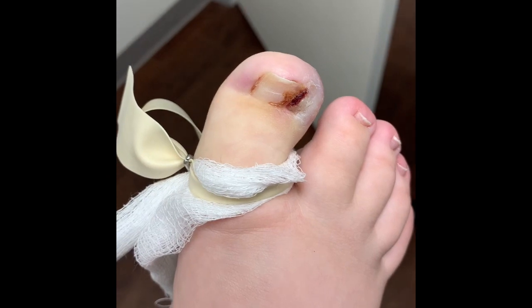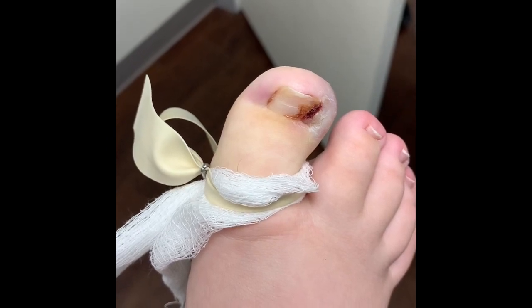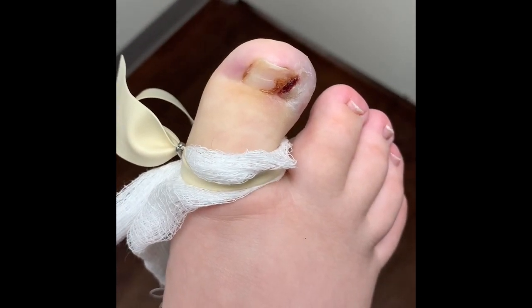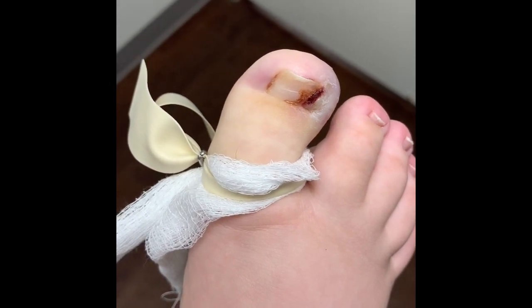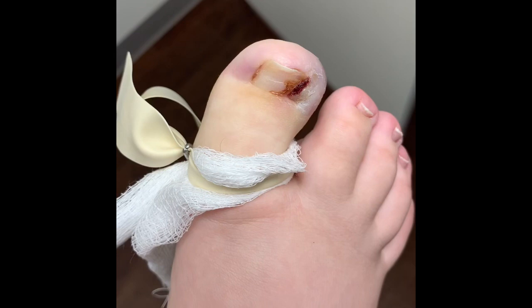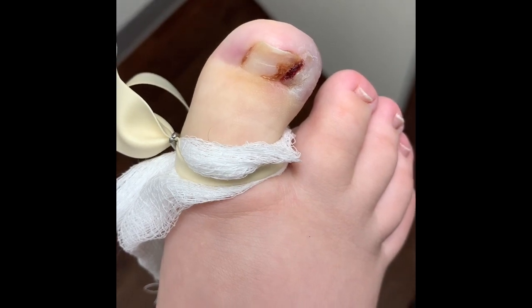You guys will be able to see clearly, which is great. Even when I perform my procedures there's minimal blood. Nonetheless, Dr. Kushner is going to go ahead and perform a phenol chemical matrix ectomy, also known as the permanent procedure. This has been a chronic problem for this patient, so we're going to go ahead and get started.